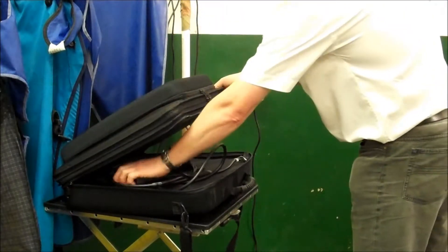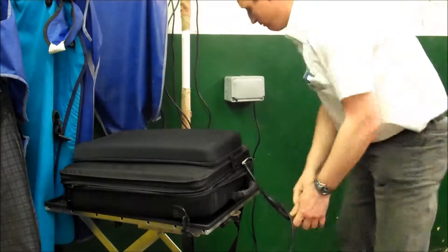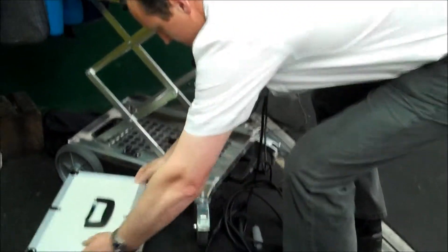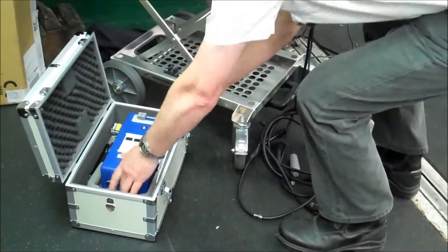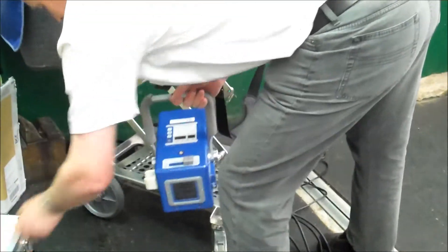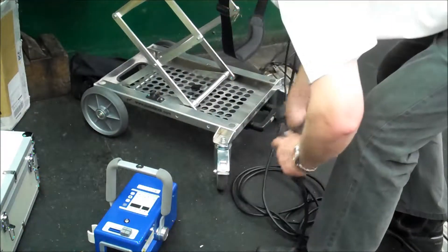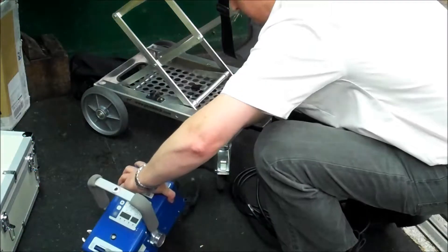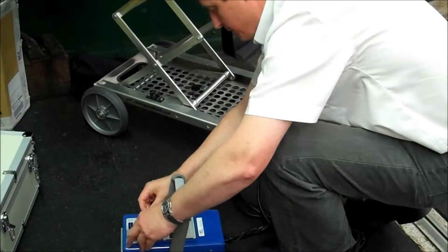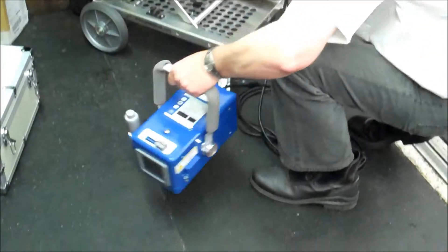I need to connect the power cable and the same cable to the generator. So firstly, connecting my power cable. I'll take out my generator, connecting my single cable, and then turning my generator on.